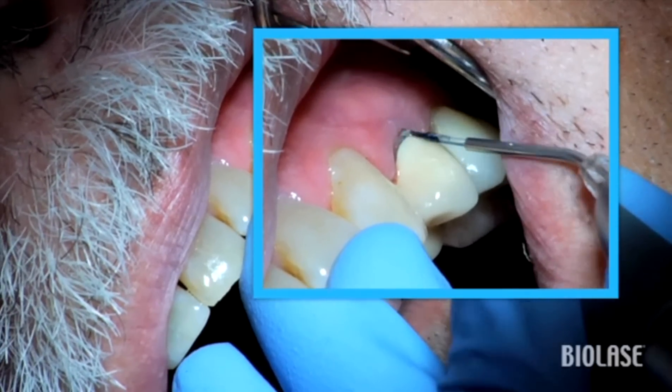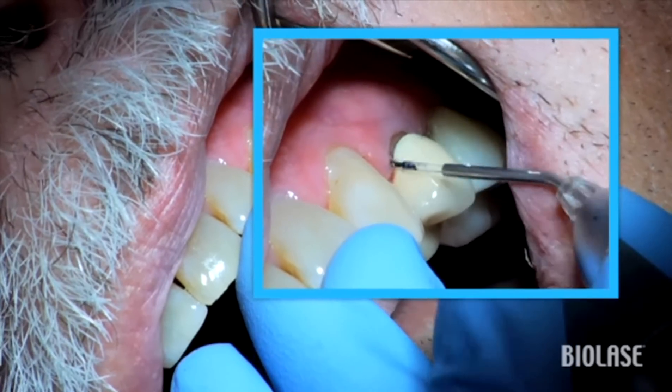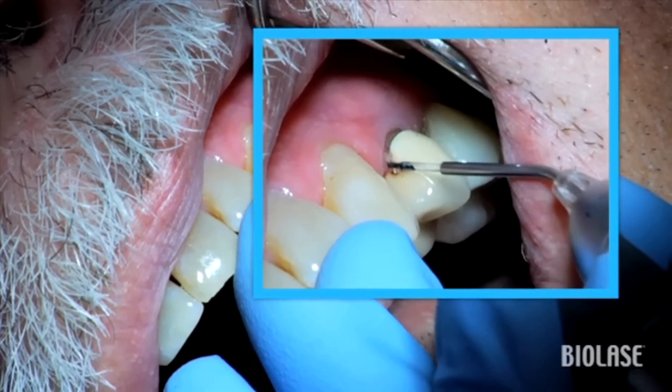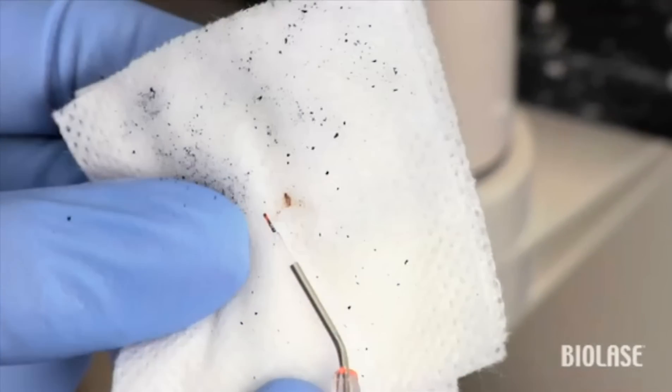She is utilizing the zigzag technique on the mesial and distal aspects of this tooth by using the tip like a probe in a zigzag pattern. The circular method is being used on the buccal aspects. And you can see the diseased tissue accumulating at the end of the tip.